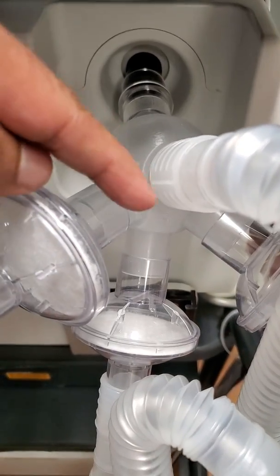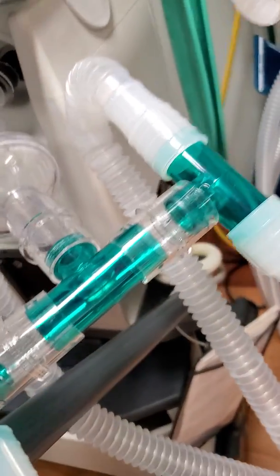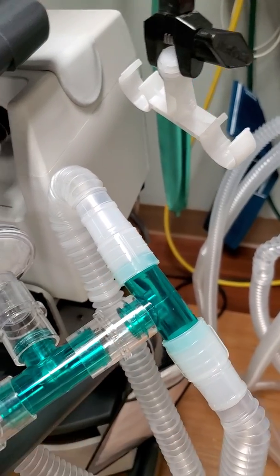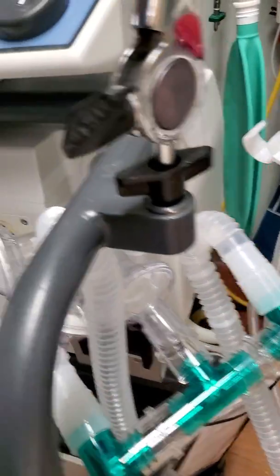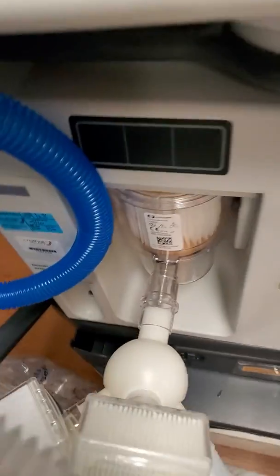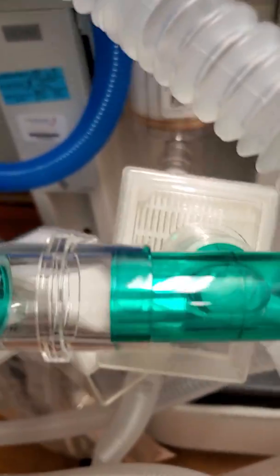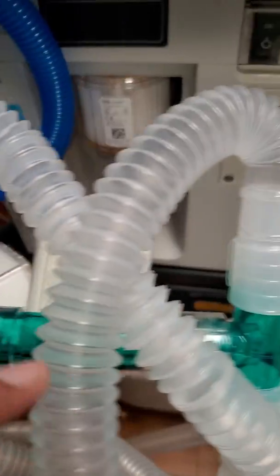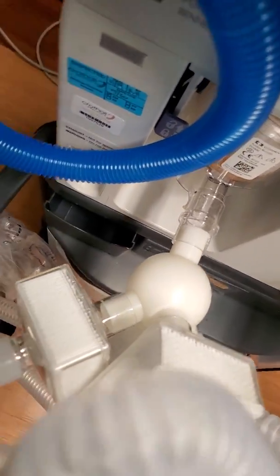Now, if you look, we have the 4 branches, and on one of those we have put a T-piece and divided it into 2 pieces. And then each of those 2 is divided into 2 more. So this one outlet is equal to 4, and then 5, 6, 7 patients are connected to this. On the exhalation part, we have a similar setup with a different color so that we can separate them out. These are the filters that we have placed in. Again, you're seeing the T-pieces connected with 2 extra ones and 2 on this side, and then we move forward and see that there are 3 others connected to this.